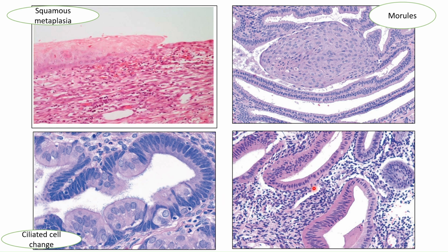In this slide, we can see normal endometrial gland and stromal component, but a few glands show abundant eosinophilic cytoplasm. Here, the normal part and some part showing abnormal or pink eosinophilic cytoplasm, abundant in nature. So, this is eosinophilic cell change.